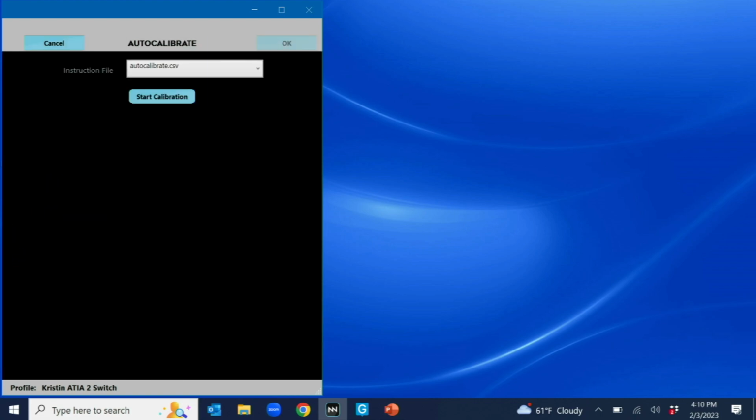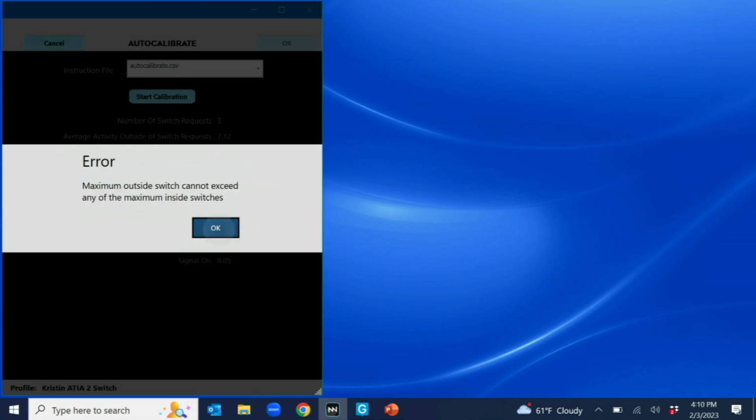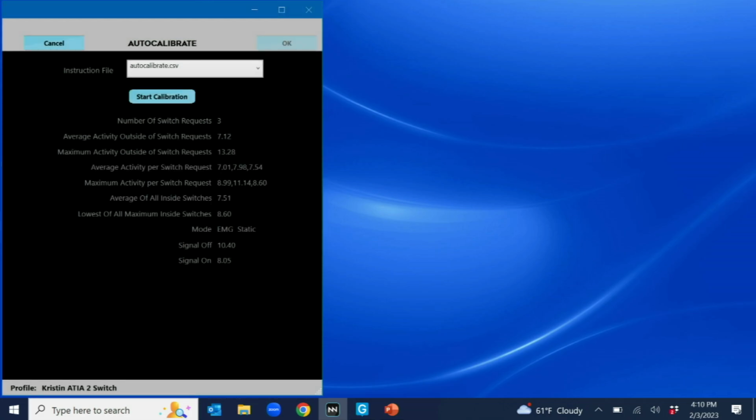You want me to do the same kind of movement? Just same kind of movement, and it will tell you. It's going to do a little countdown, and then it'll say activate. So this 3, 2, 1 is just before it starts. And it'll give you another 3, 2, 1, and when it says activate, move your finger. Okay, and then it'll do it again, because it's going to get 3 trials of this. Okay? And then it'll do it one more time. Okay? All right, so now it's saying, all right, in these 3 trials, we figured this out. We're going to set the signal off at this and the signal on at that.